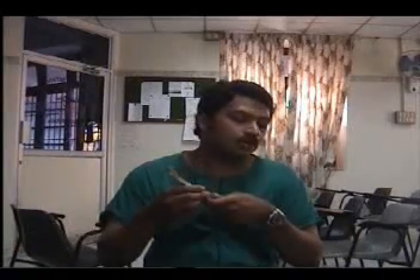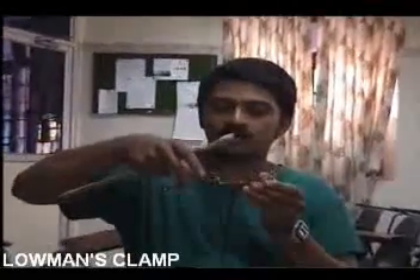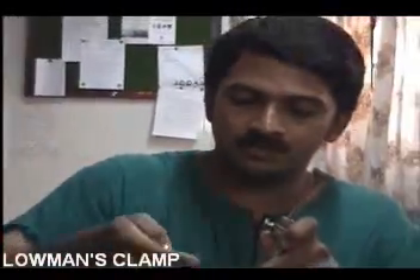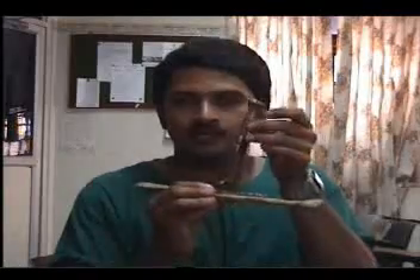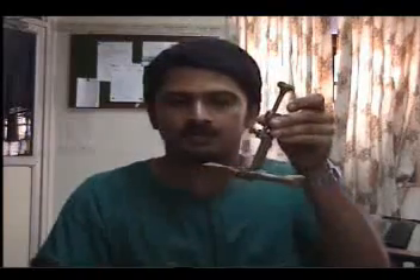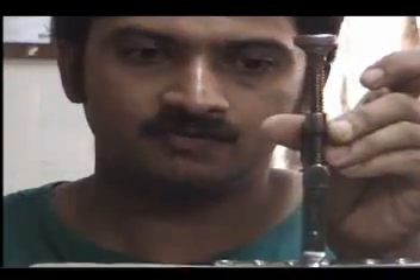Another instrument commonly used to hold the plate to the bone is the Lowman's clamp. Even though it is a clamp just like the others, it is very different in the way it is constructed, but again a very simple design. The plate is fixed onto the bone and you simply tighten the Lowman's clamp here — it comes down and effectively fixes the plate to the bone.